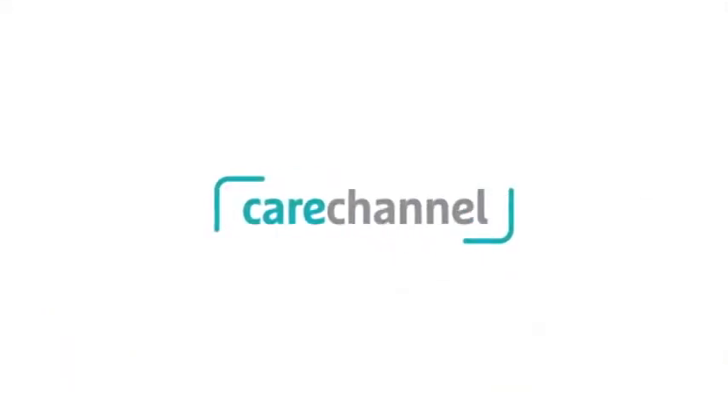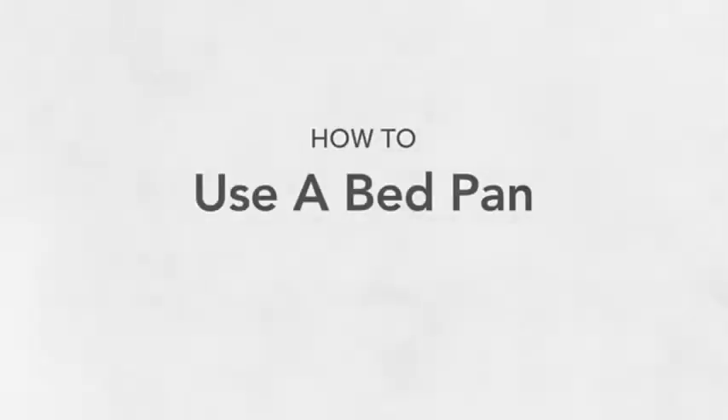In this video, we'll review how to use a bed pan so that you can develop your skills and make the process a little quicker, so you can both get through it a little easier.